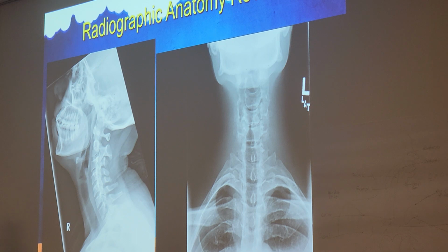They're flexing their neck. First off, the neck is flexed, which we don't need to have on that. But what else? Well, we're not really worried about the shoulder. We're not looking at the spine. What's our star of our show? Exactly. Soft tissue. What are we looking at for soft tissue neck? The soft tissue and the what specifically? Right, the air-filled trachea.